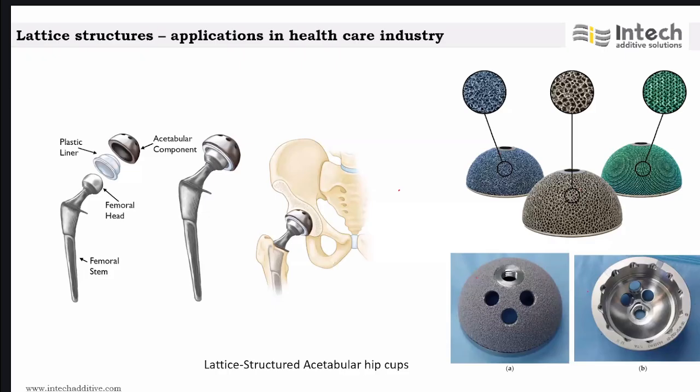Yes, it is there, for integration. And on the other side, you could see that it's been machined, so you have a very smooth surface, and you have some screw holes. So this classifier.